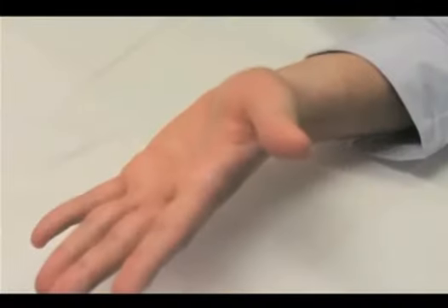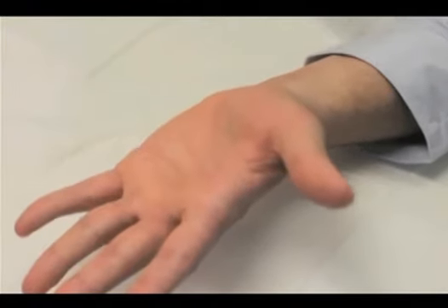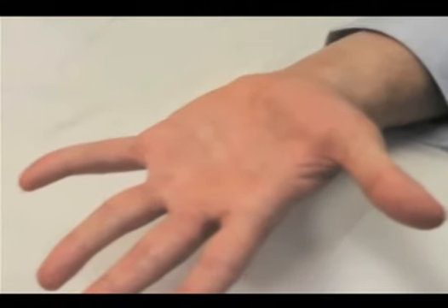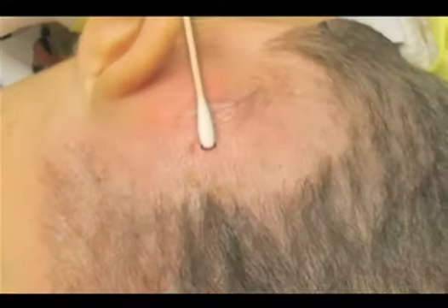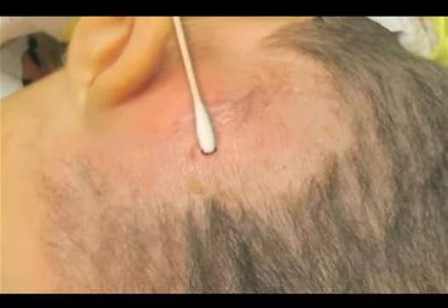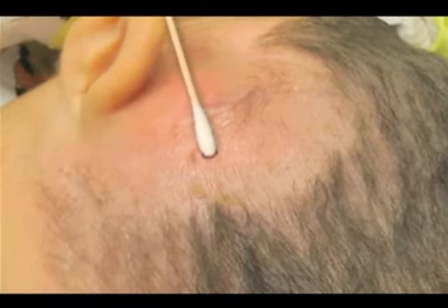When performing a punch biopsy on the palm, for instance, recall that there is very little subcutaneous fat and that once the entire dermis is breached, the instrument is essentially at the level of the fascia. Consequently, do not press hard on the punch. When taking a specimen from the highly vascular scalp, be prepared for brisk bleeding, as shown earlier. The bleeding can be easily controlled with the application of pressure and the placement of the first suture.